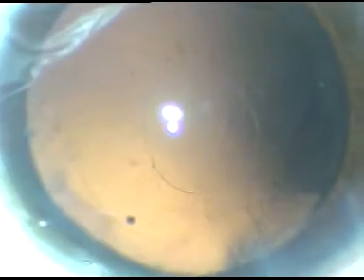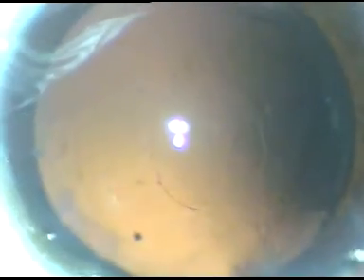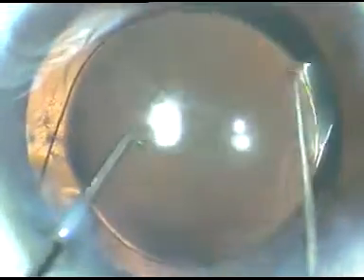Posterior Continuous Curvilinear Capsulorrhexis. And if the posterior rhexis is of this size, it is very easy to place an intraocular lens in the capsular bag. The leading haptic goes between the posterior capsule and the anterior capsular rim. I introduce a Sinskey hook through the right side port, dial the lens, and place the trailing haptic in the capsular bag. I then dial the lens again and place the haptics in the horizontal meridian.